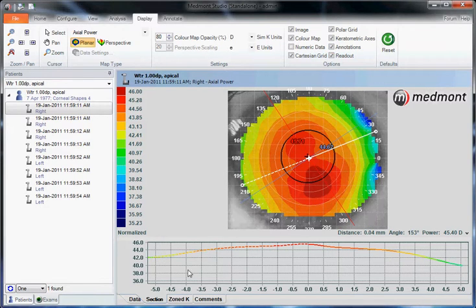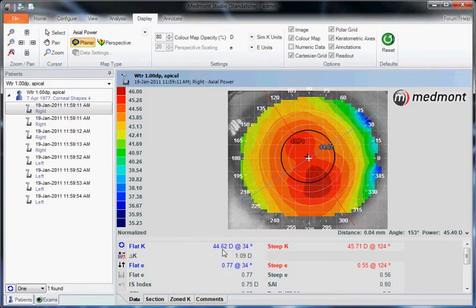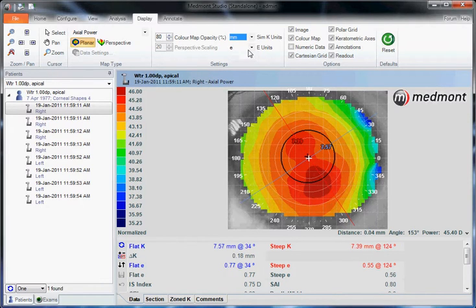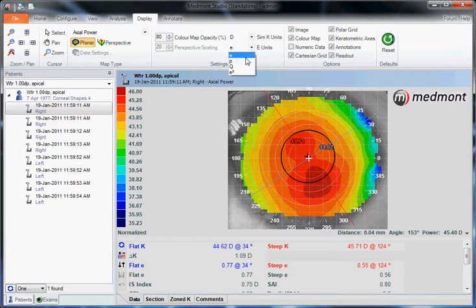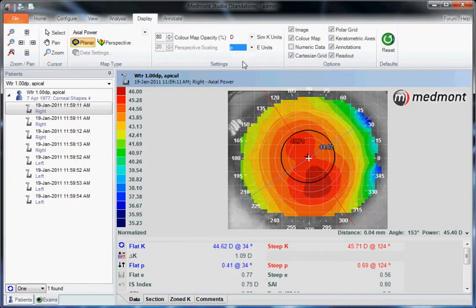If you prefer to think in terms of key readings in millimeters, you can change your simulated K readings to millimeters from diopters. Or if you think in terms of shape factors rather than E value — whether you prefer P, Q, or E squared — you can change those here.